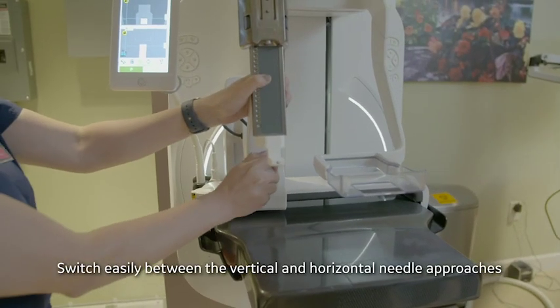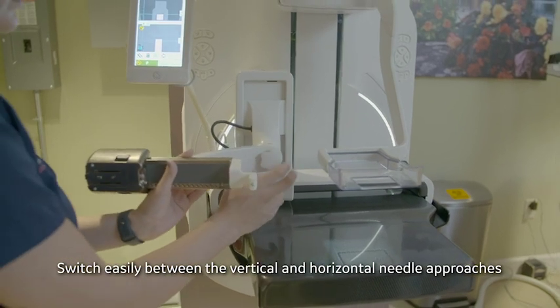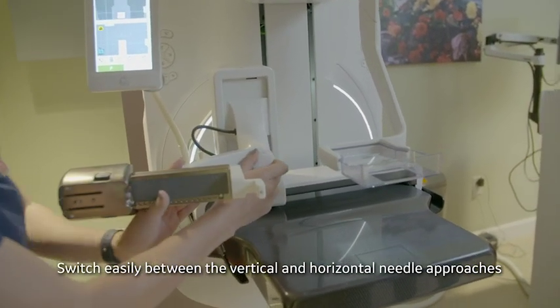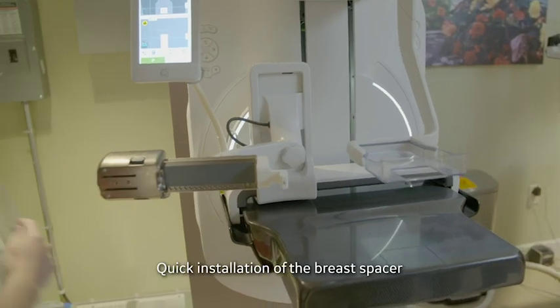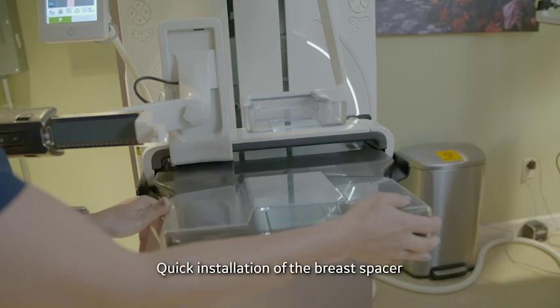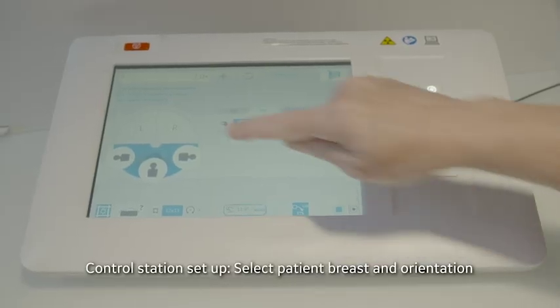For this first exam, the technologist will pivot Serena to the horizontal approach. We add a breast spacer for this patient. Then we set up the console.